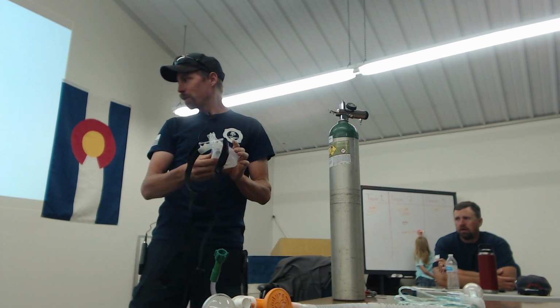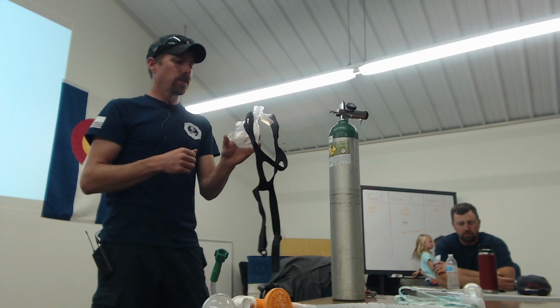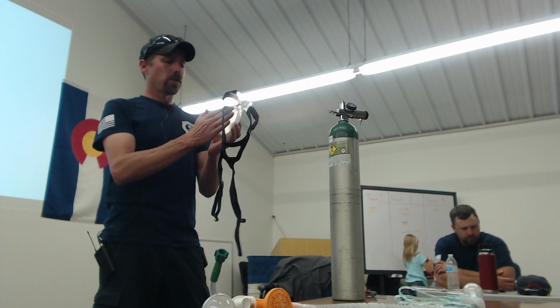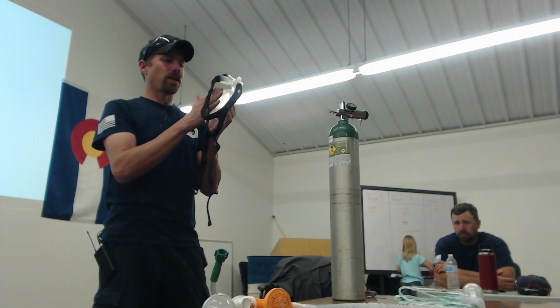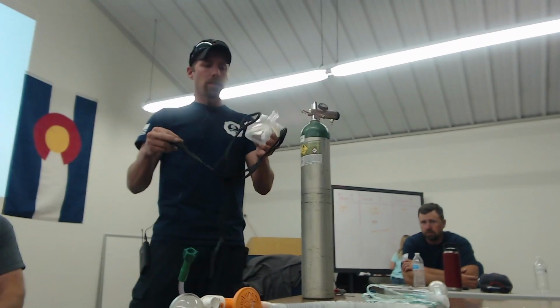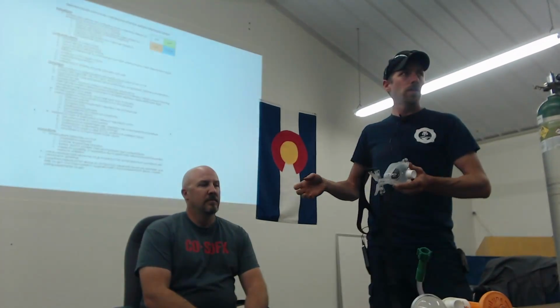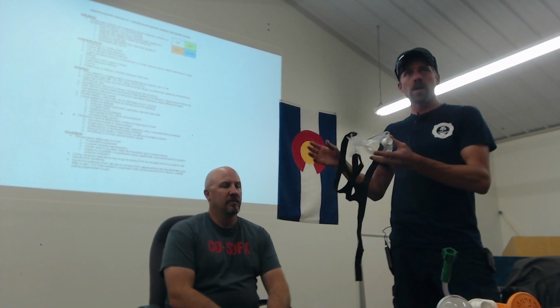I think this is a medium size. It's probably going to be a little small for him, but you're going to want to get the appropriate size mask. I would say he'd probably be a regular adult, so that you get a good seal and you're not trying to work around. If we're doing this, you probably got your patient on, say, 15 liters non-rebreather. So they're on a mask already.